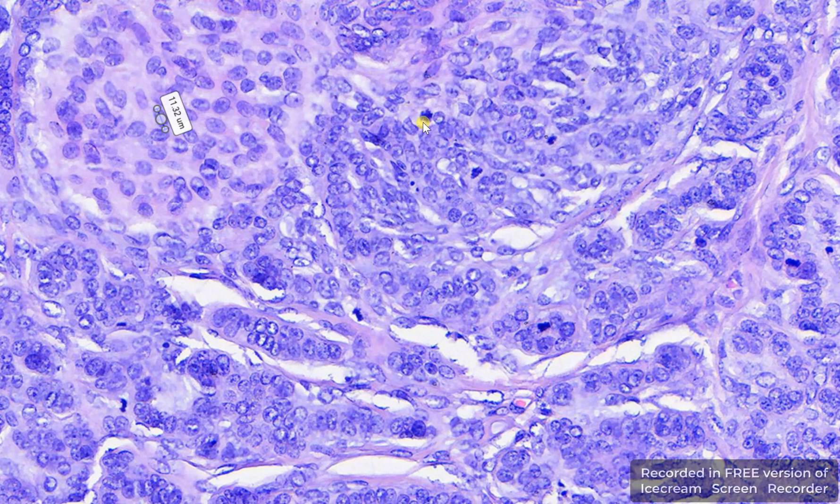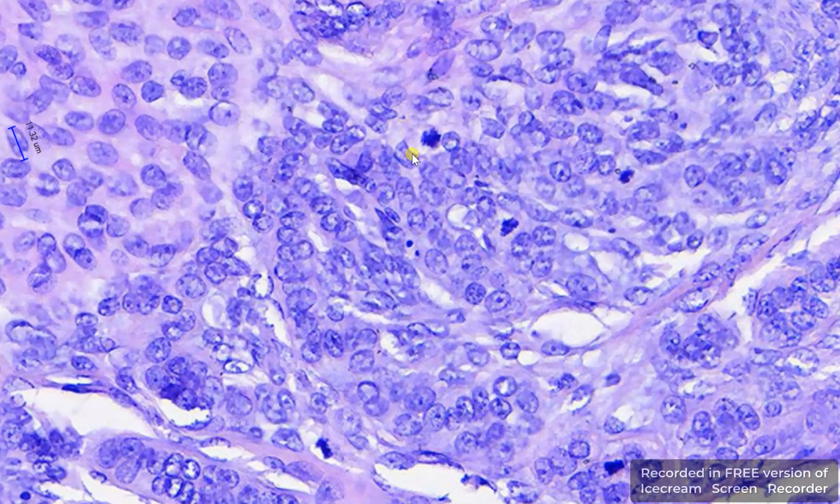I wanted to show you the mitotic figures, and if we count together in this field of view, we have 1, 2, 3, 4, 5, 6, 7 mitotic figures in this area. And this is what I wanted to show with this video.